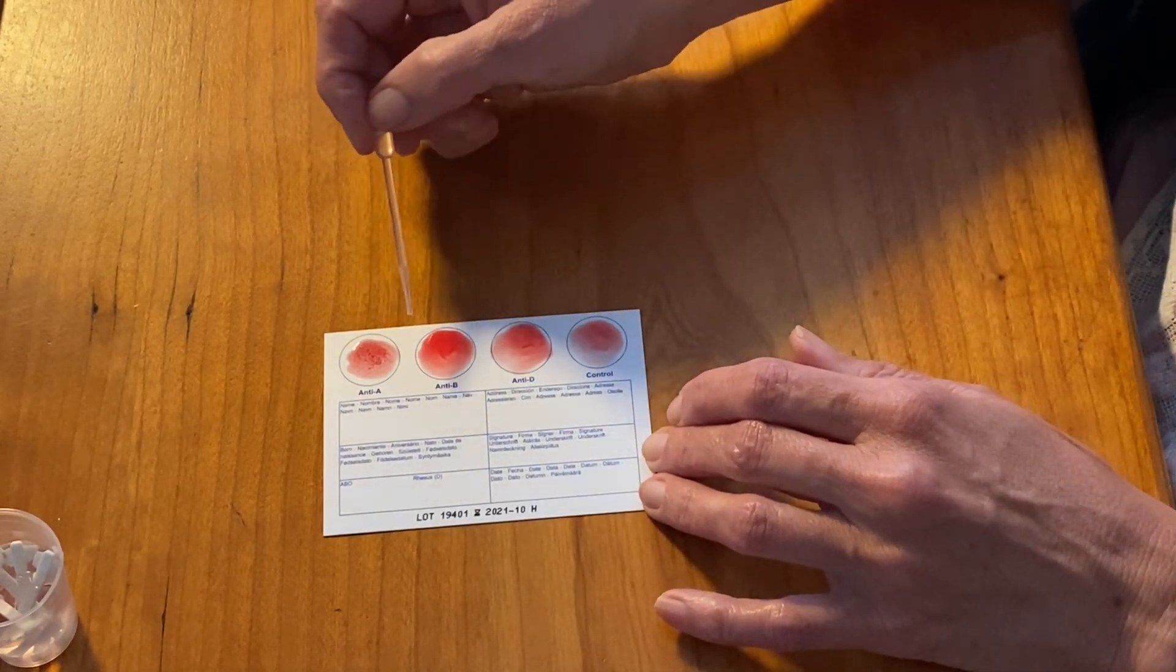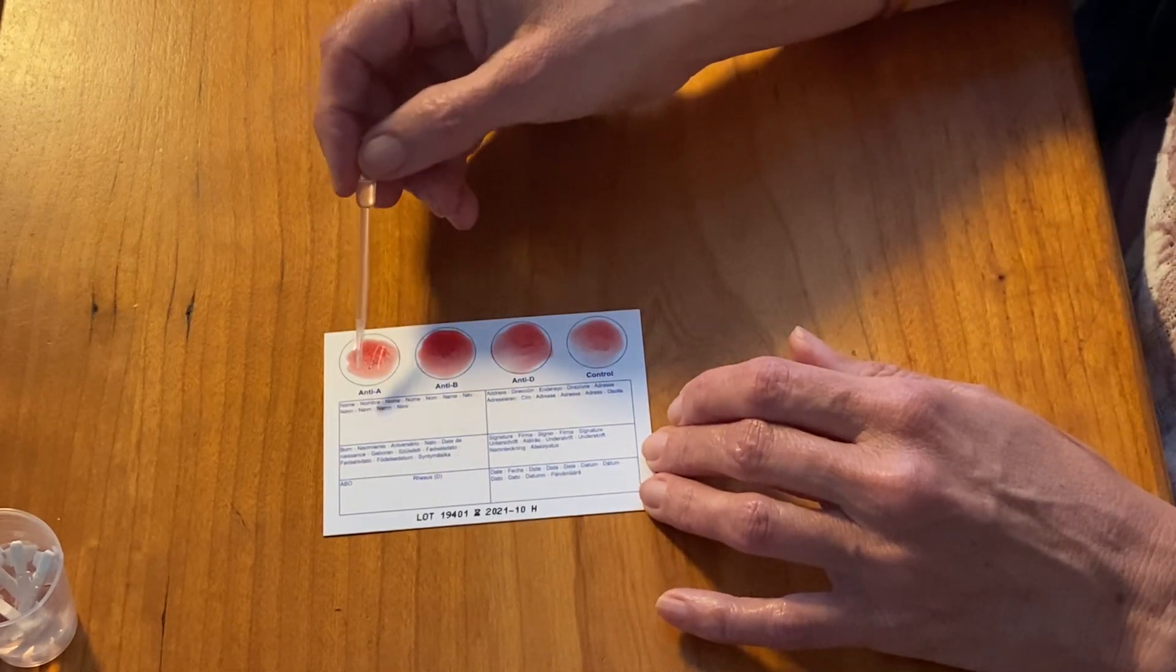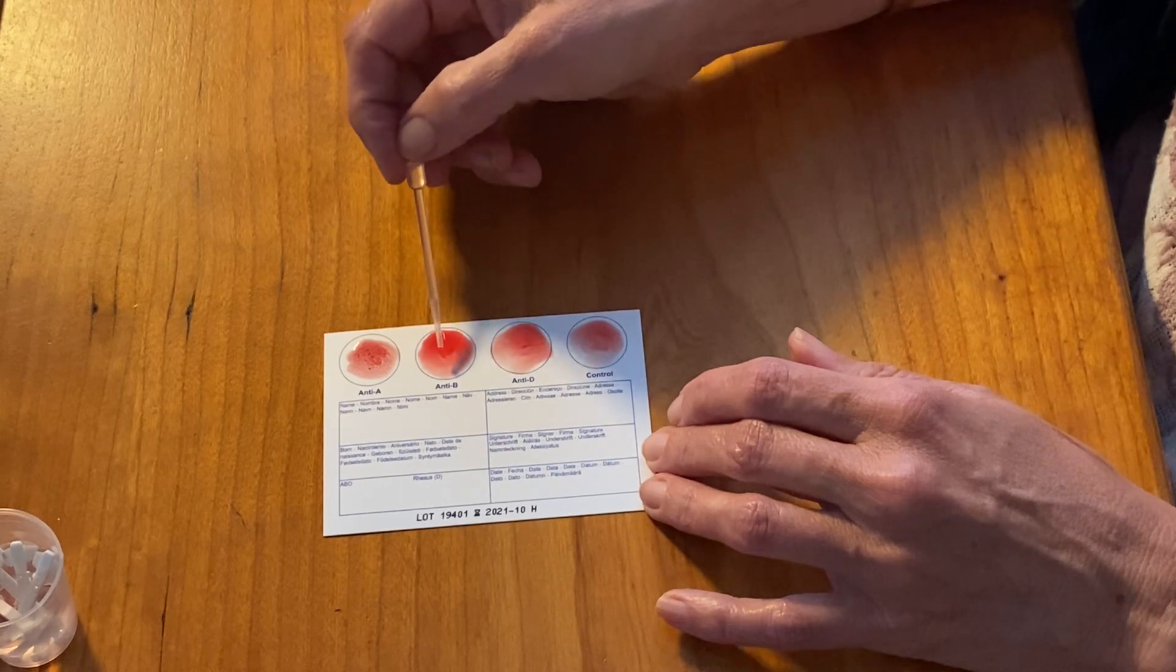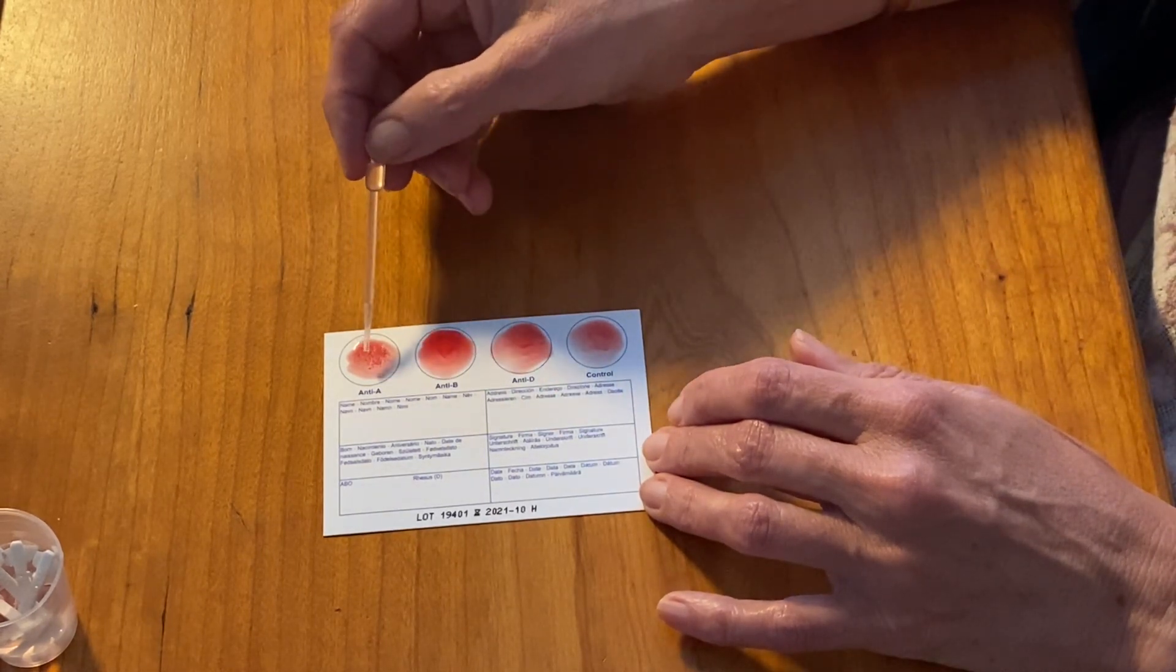If I was B this would have coagulated and this would have stayed smooth. If I was O both would have stayed smooth. If I was AB they would have both coagulated.